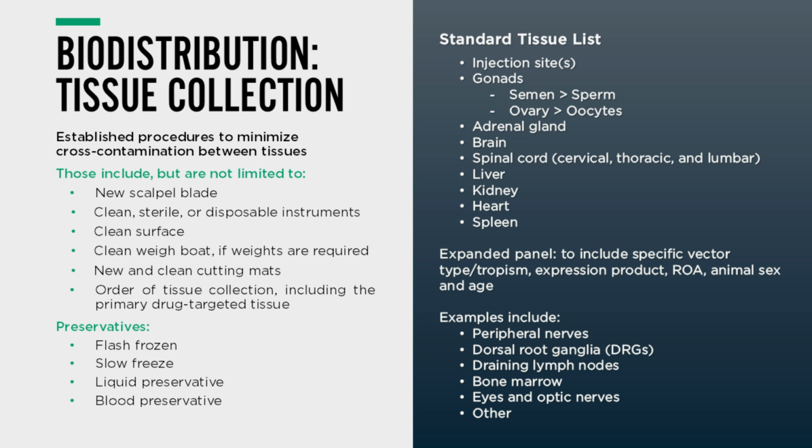And when samples are collected, we can employ the use of preservatives or implement rapid storage procedures when needed so that DNA and RNA within a sample remain intact for whatever the downstream analysis may be. Part of this collection also involves the harvesting of the gonads, which are collected for a number of different data endpoints, including histopathology and biodistribution, but also for downstream gamete analysis.